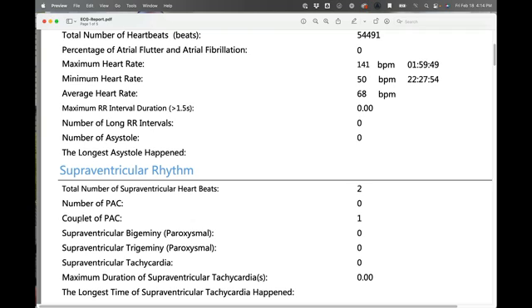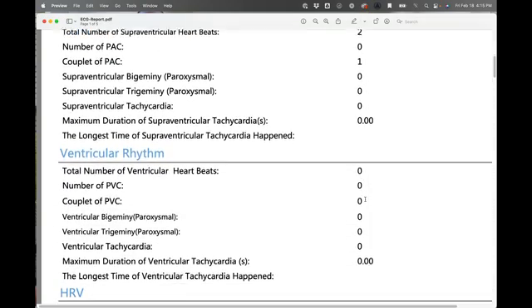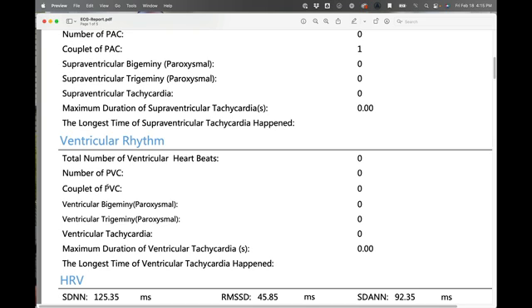I have a couplet of PAC — that's a premature atrial contraction. Basically, between each atrial contraction there's a certain amount of time. But every once in a while — you know that feeling where your heart skipped a beat or there was a quick heartbeat and then it went back to normal? That could be a premature atrial contraction: instead of waiting the normal amount of time, it contracted prematurely. I have one couplet of PAC, and since it's a couplet — two together — the total number of supraventricular heartbeats is two.